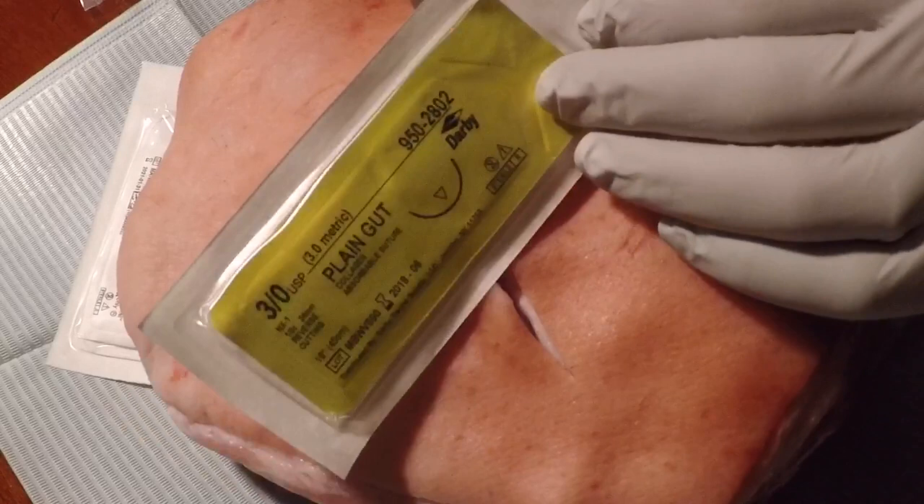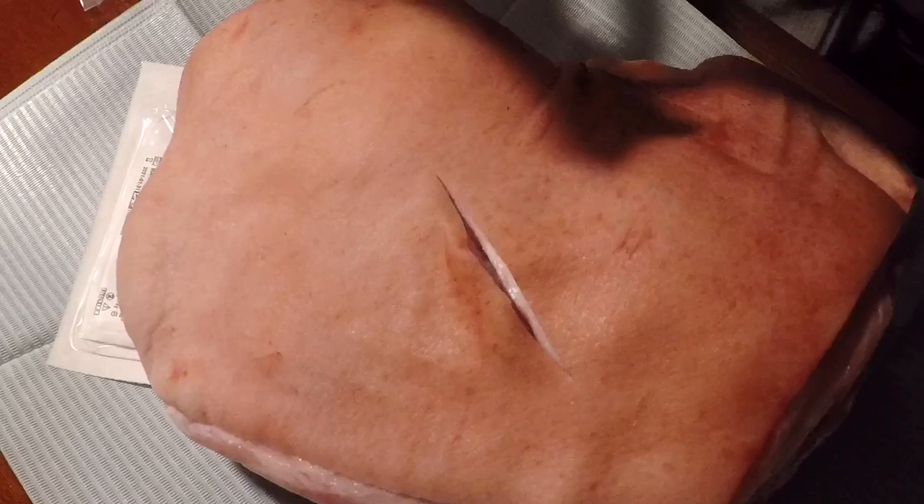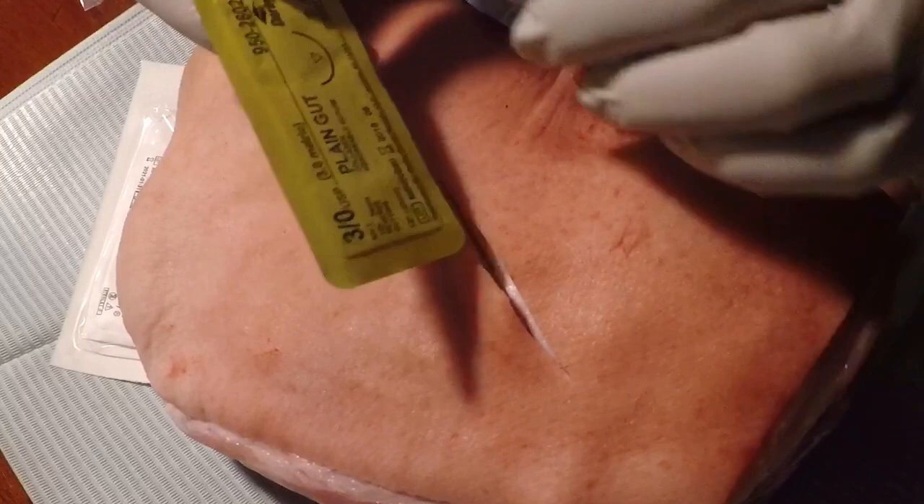For the deep sutures, you want to use absorbable suturing material so they won't need to be removed. It's very important that the sutures remain completely underneath the layers with no exposure to the outside, because if they are exposed to the outside, bacteria can run down the threads into the knot and you'll create what's known as a suture abscess.